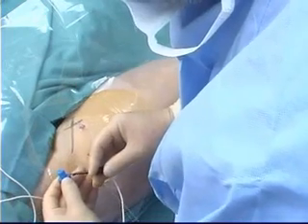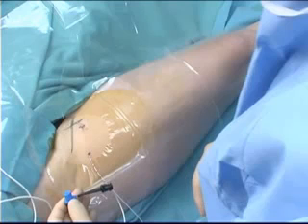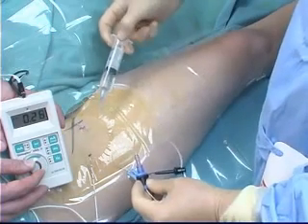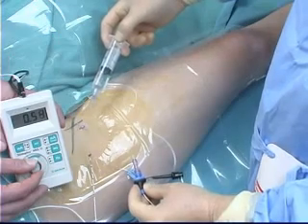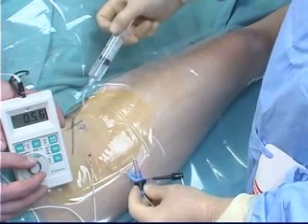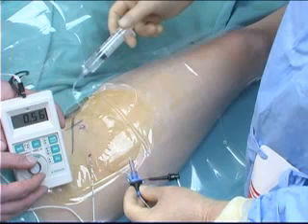The nerve stimulator is clipped to the snap lock, and the nerve stimulation is set to an output of 0 milliamps. The nerve stimulator output is turned up slowly until a quadriceps muscle twitch can just be seen. Local anesthetic agent, or as in this demonstration, normal saline, is injected and the motor response immediately stops. This constitutes a positive Raj test, which is a further indication that the secondary block will be successful.